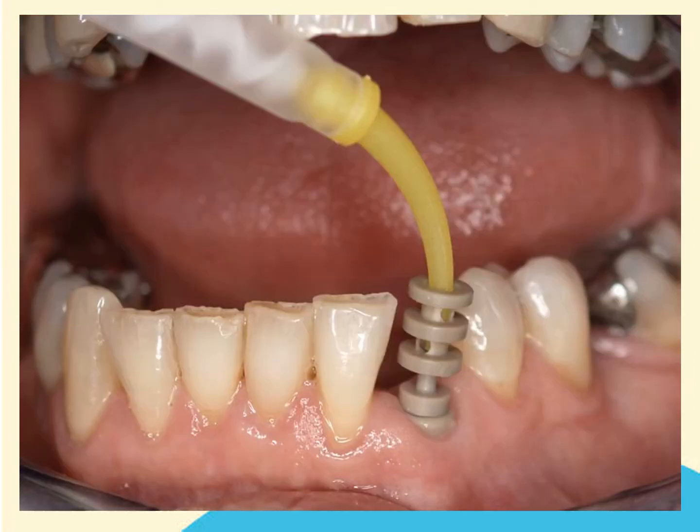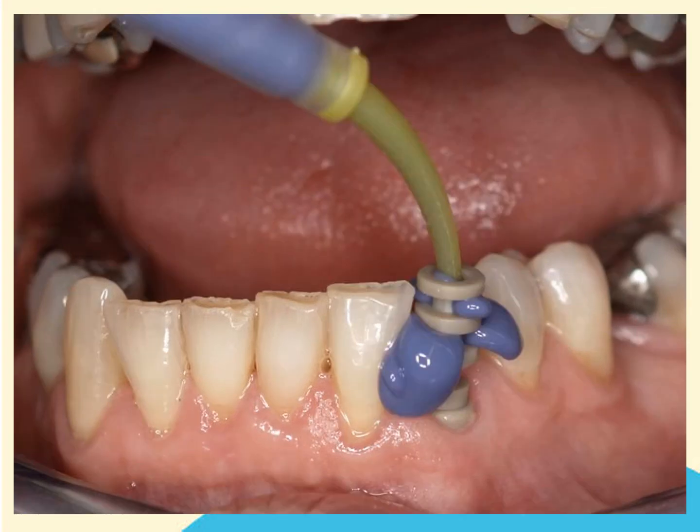The tip of the impression syringe is introduced into the top of the clicking top. Impression material is injected through the top of the clicking top so that it vents out through the side ports. When the impression tray is removed, this will help secure the clicking top in the impression material. It is important that you use a hard set impression material such as Imprigum Hard, a polyether — not a light-bodied silicone or even a heavy-bodied silicone, as these may either displace the clicking top or may not grip it securely enough for it to be withdrawn in the impression.